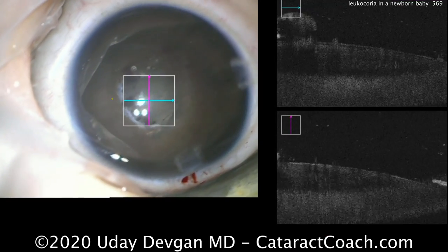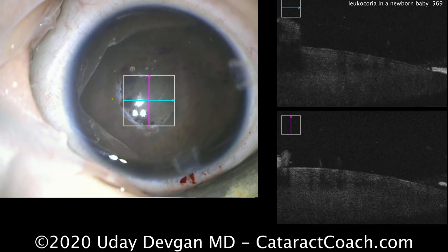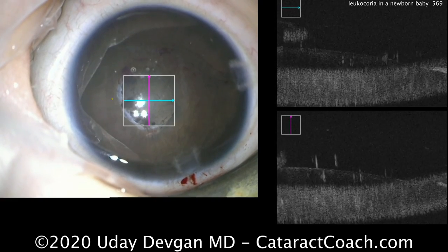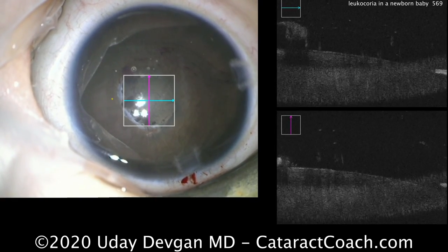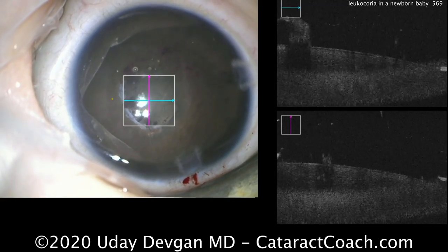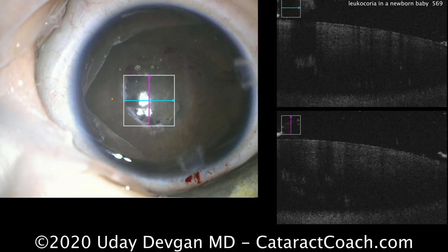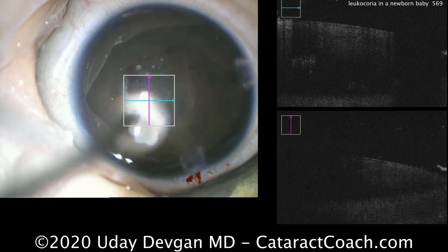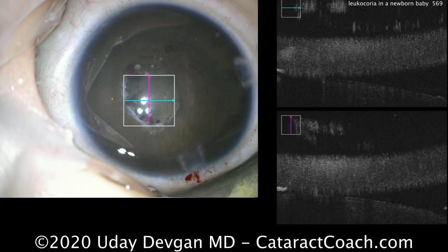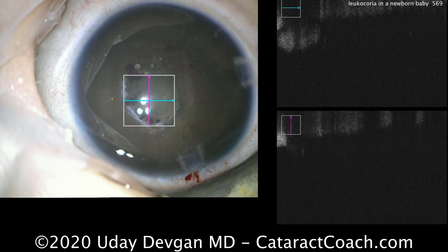Here's after removal of that membrane — we see the intraoperative OCT image again. We can see it's a nice, clear crystalline lens with no opacities, and now it's a nice large pupil to allow in sufficient light. The baby had a complete exam under anesthesia. Fortunately, everything else looked pretty normal, and the posterior segment did appear to be intact with no evidence of other ocular disease.